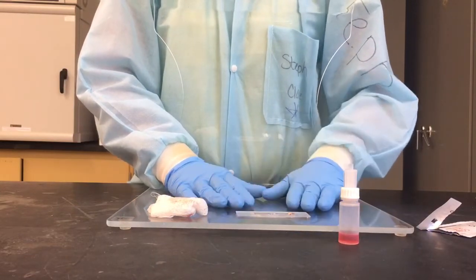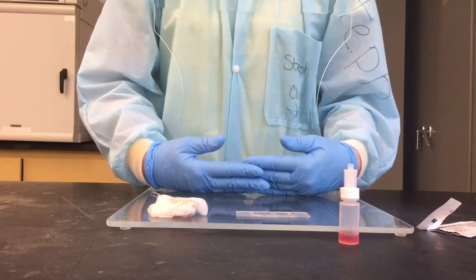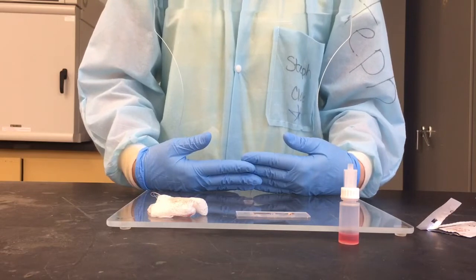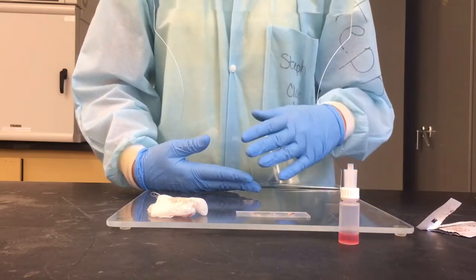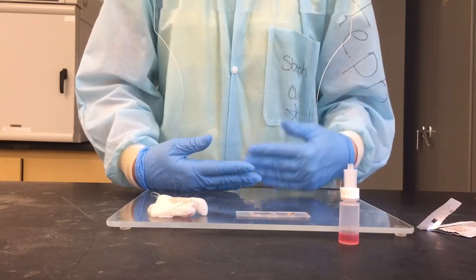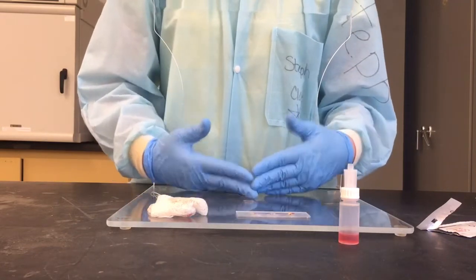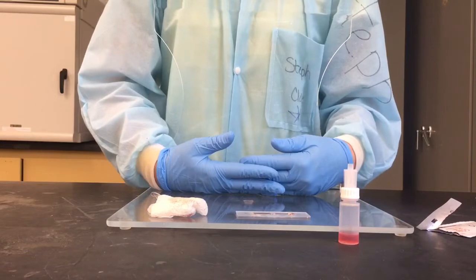So when we are in lab, I will have my hemocytometer set up to the projecting microscope, and I will show you what the grid looks like. I will show you what the white cells themselves will look like, but it's very, very important that you remember that when you're setting up your microscope, you need to turn your condensers down and you need to turn your light down. You probably are going to want your light somewhere between 5 and 7, and you're going to want your condenser halfway or more lowered.